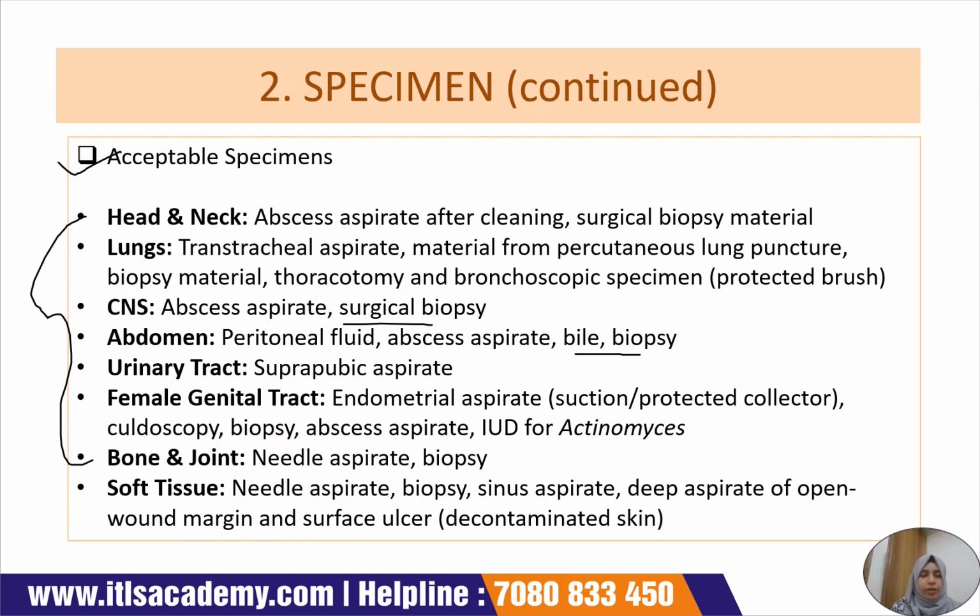Okay. From urinary tract, suprapubic aspirate is considered good. From female genital tract, endometrial aspirate is considered the best specimen, and that must be taken via suction or via a protected collector. Culdoscopy, biopsy material, abscess aspirate, and IUD for Actinomyces are considered suitable specimens for anaerobic recovery.